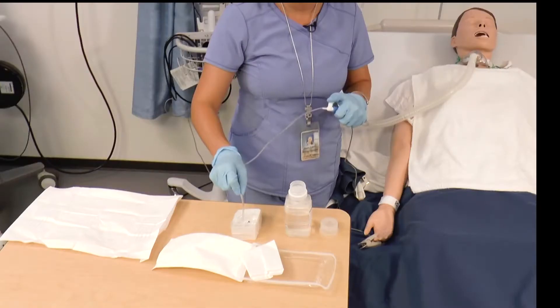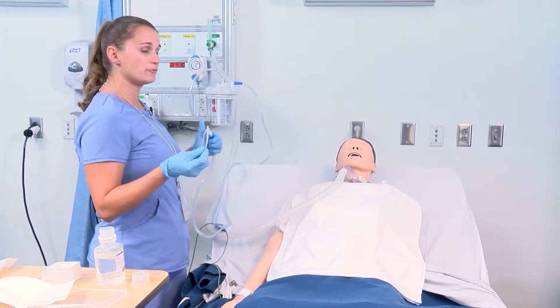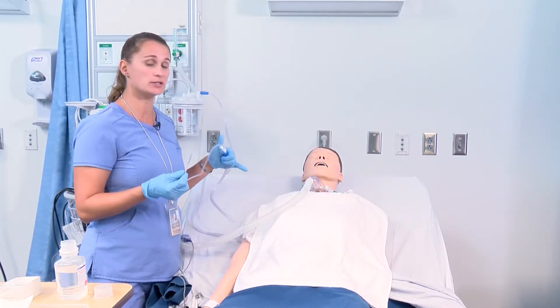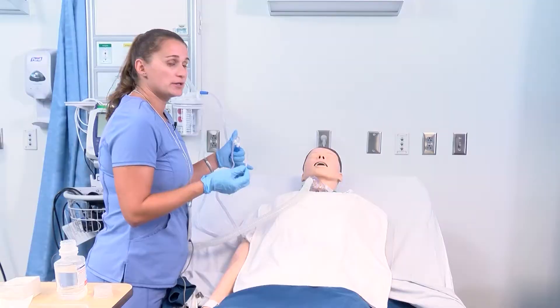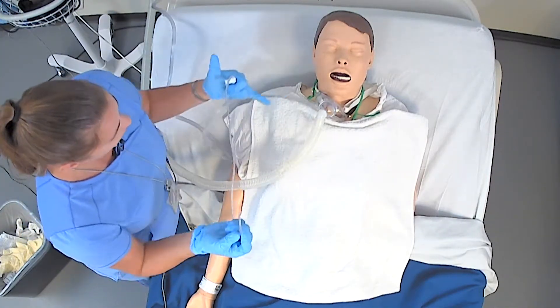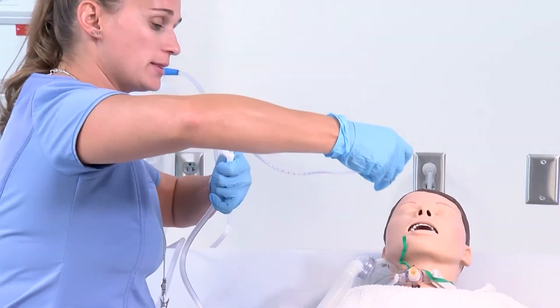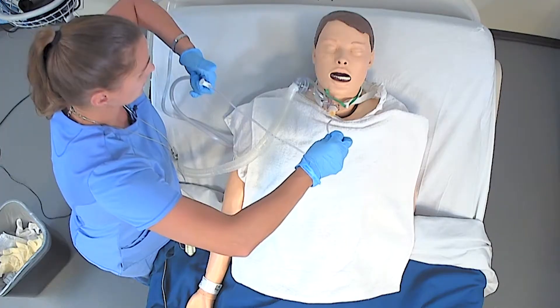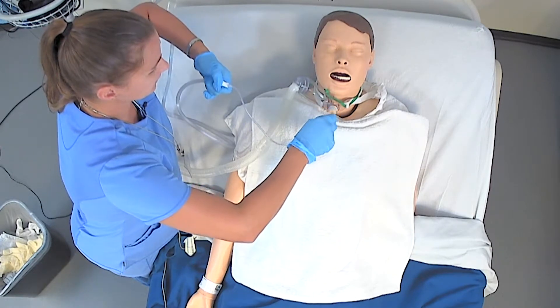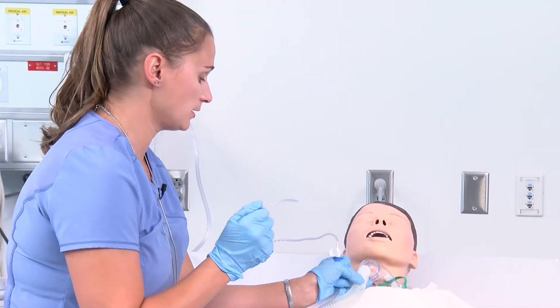I'm going to clear my tubing and make sure there are no secretions clogging it. I observe the oxygen saturation and assess what the patient looks like — is he ready for another pass or does he need more time? If his SATs are greater than 92%, or whatever your hospital protocol is, you would proceed accordingly. I remove the oxygen again and do one more pass, keeping my elbows up and not touching anything with my sterile gloves, insert the catheter, meet resistance, intermittently twist and suction out, then replace the oxygen for Mr. Jones.